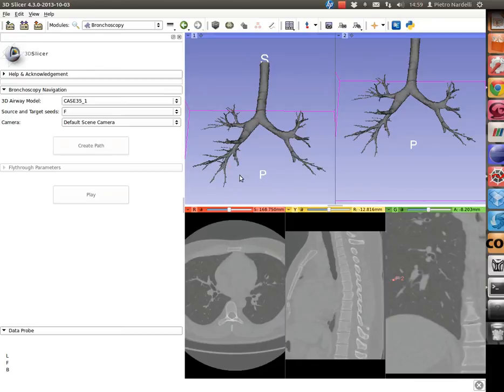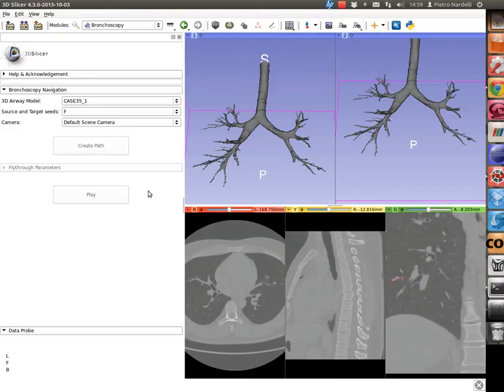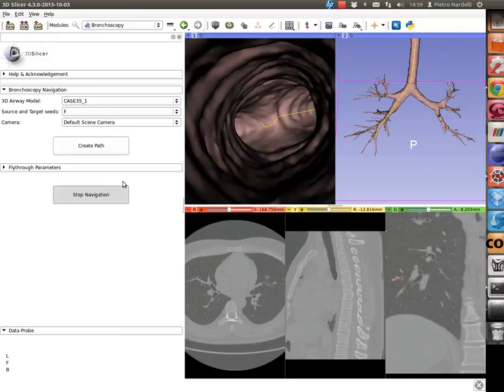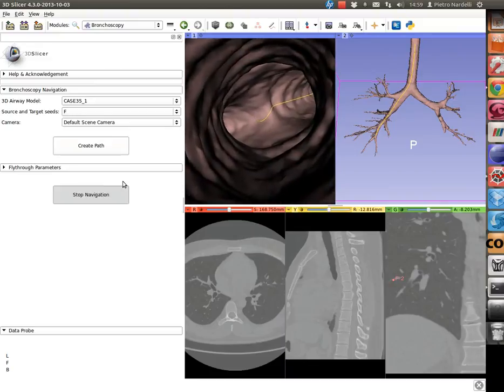Click on the create path button and wait until the play button becomes available. When so, click on play and the navigation inside the airway will start.